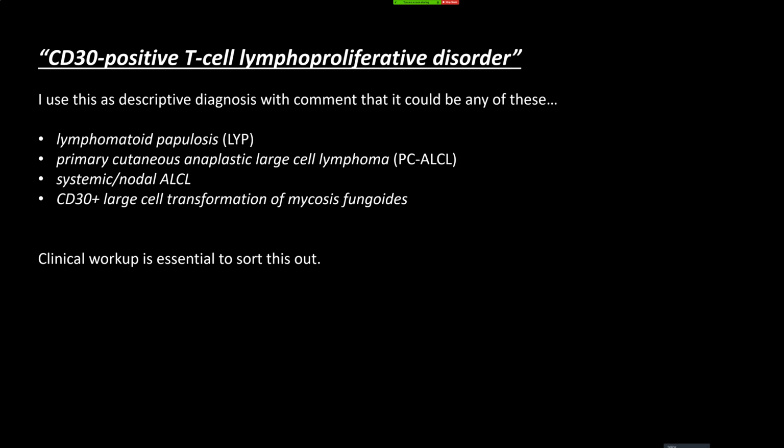Yes. I'm curious, for cases like the ALCL one you were talking about, do you normally put those recommendations for workup in your sign out, or is it expected that you do that? Well, a lot of people have different views about how much a pathologist should say in their comment about what should be done clinically. So it depends on the situation.